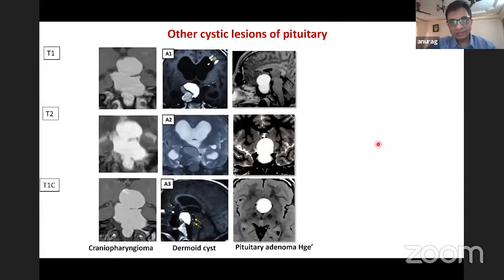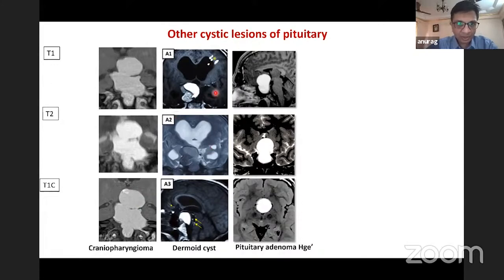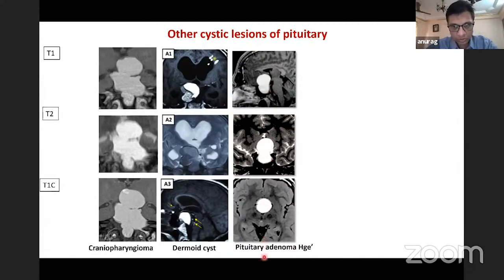Craniopharyngioma is another differential for cystic lesions — hyperintense on both T1 and T2 with partial contrast enhancement if solid components are present. A dermoid cyst is also fat-containing and hyperintense on T1 and T2; ruptured dermoid cysts show fat that has migrated into the meninges. One case looked like a cranio on MRI but had a normal pituitary behind it; HPR revealed a subacute hemorrhage into an adenoma, which appeared hyperintense on both T1 and T2.